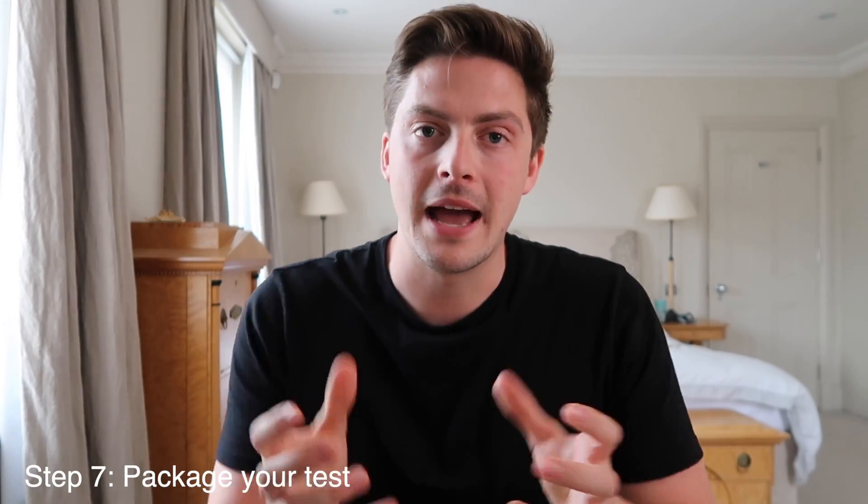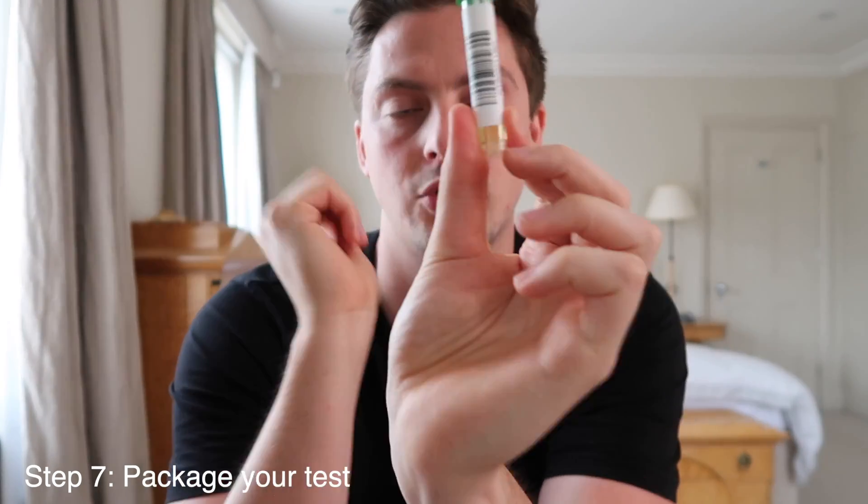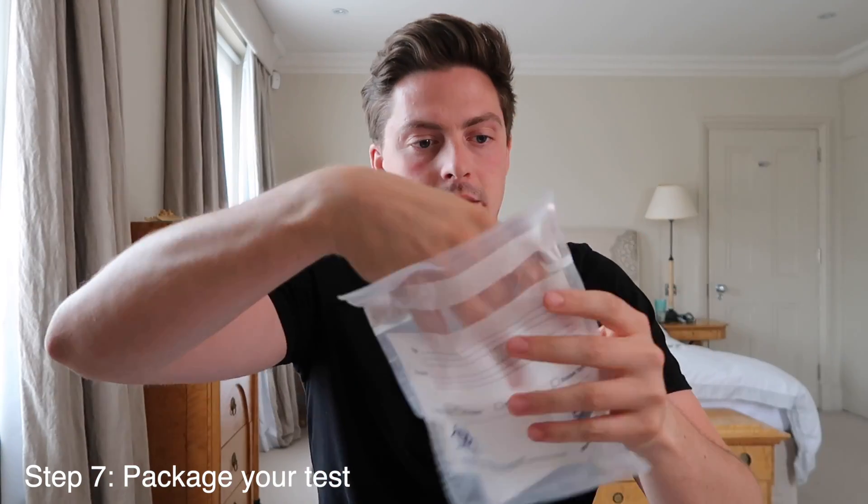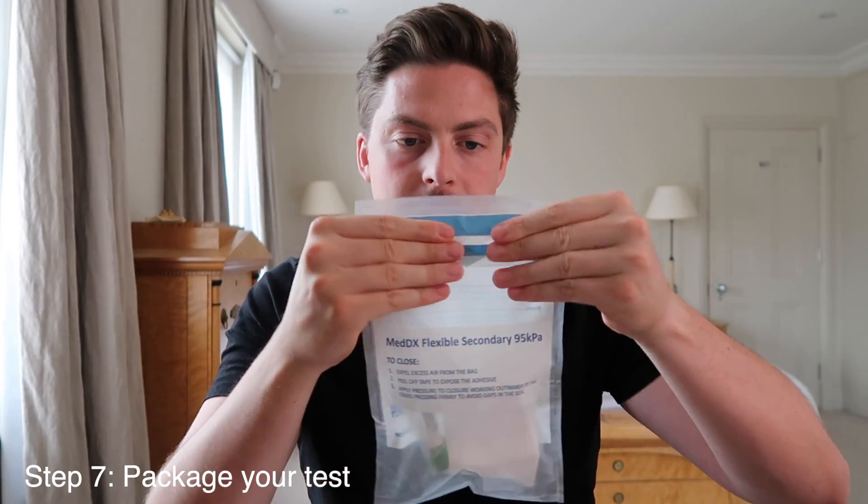Now it's time to label up and package the sample. Take the barcode sticker and apply it vertically on the test tube. Next, take your absorbent pad and place it inside the first clear plastic bag along with the test tube — that's all fine. Then place everything into the biohazard bag. Peel the silver strip off the seal, fold the top over to seal the bag securely. Then apply your second barcode to the outside of the bag so it can be tracked. The other two barcodes you keep for your own reference.